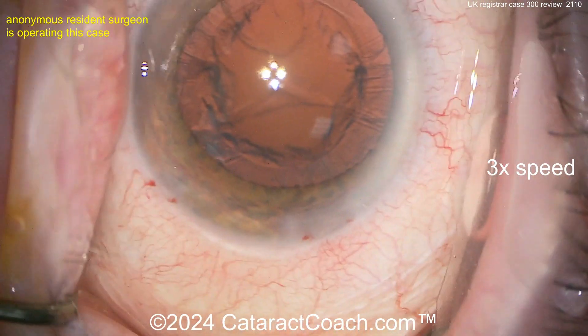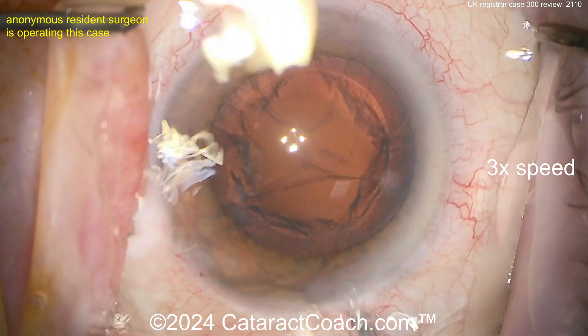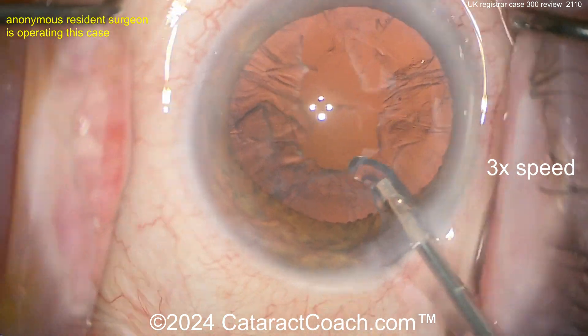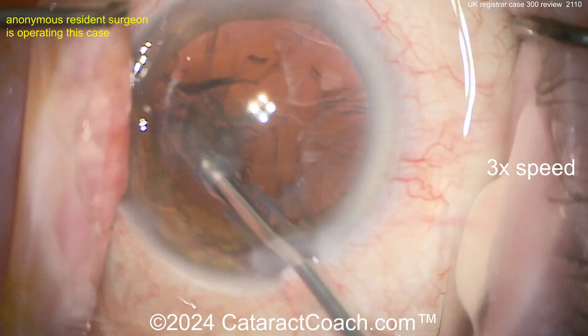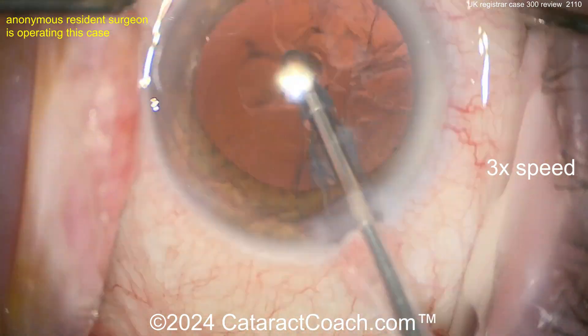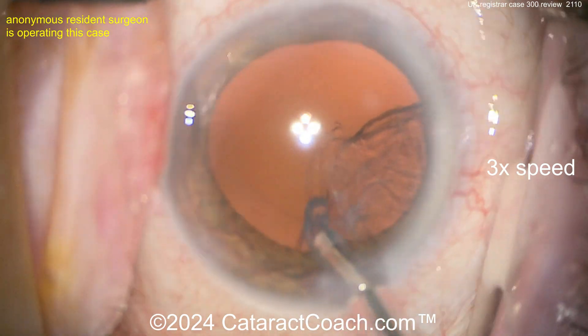Nice draping, eye staying in primary gaze. For cortex we're going to be coaxial — because there's only one paracentesis. Here's the coaxial I/A probe taking out the cortex, nicely done, taking it off in big sheets.